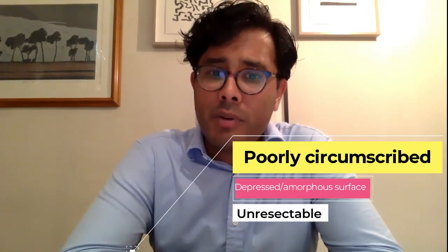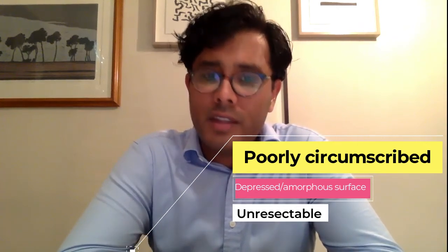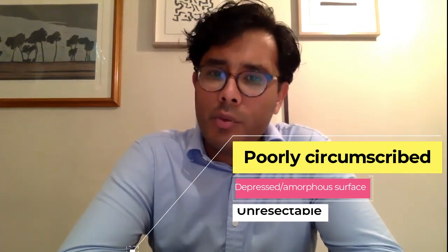Unresectable lesions are typically those with indistinct borders or that are poorly circumscribed, with a depressed surface or an amorphous surface, and these lesions should be biopsied with sampling focusing on the most concerning areas and a tattoo placed in close proximity. These lesions will ultimately likely require a surgical intervention.